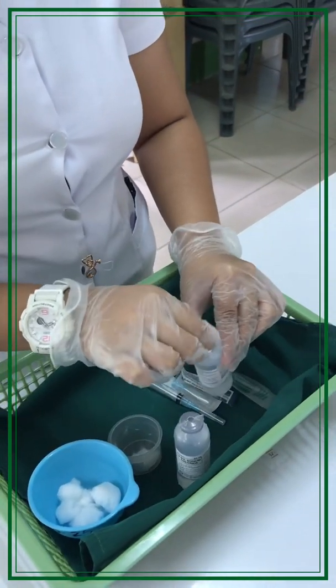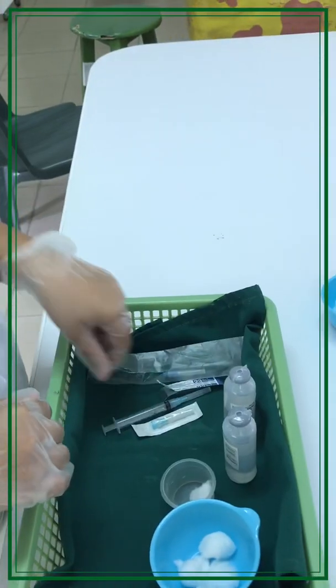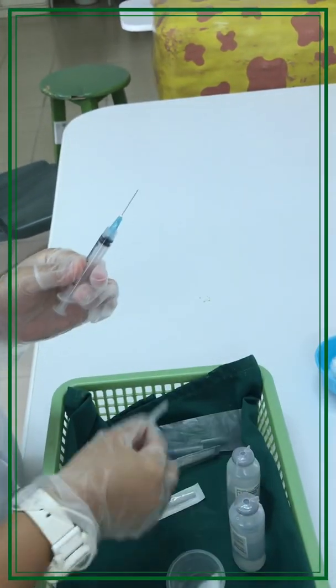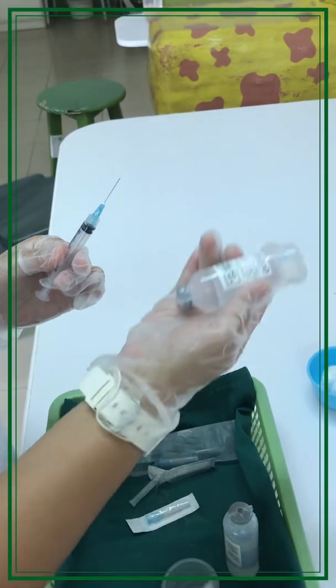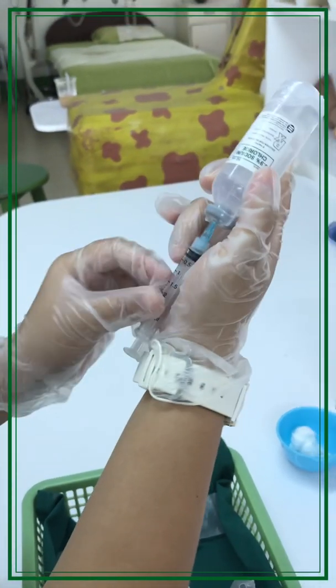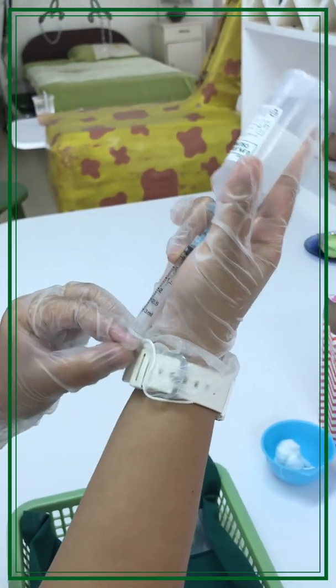Make sure to cleanse the medication vial before withdrawing. Withdraw medication as ordered by the physician, and make sure to hold the syringe at eye level.